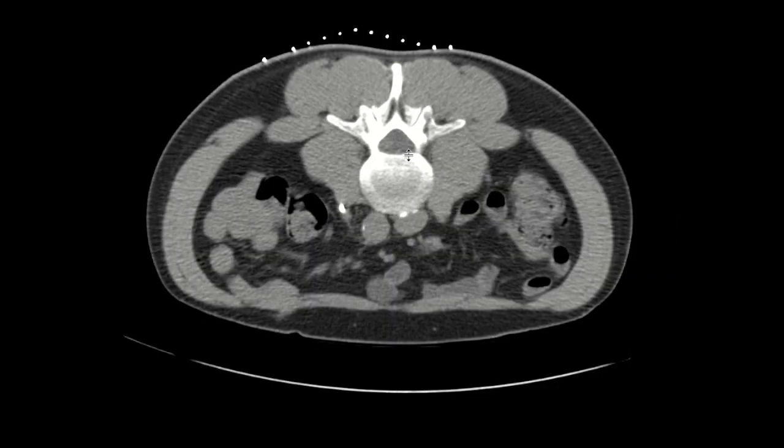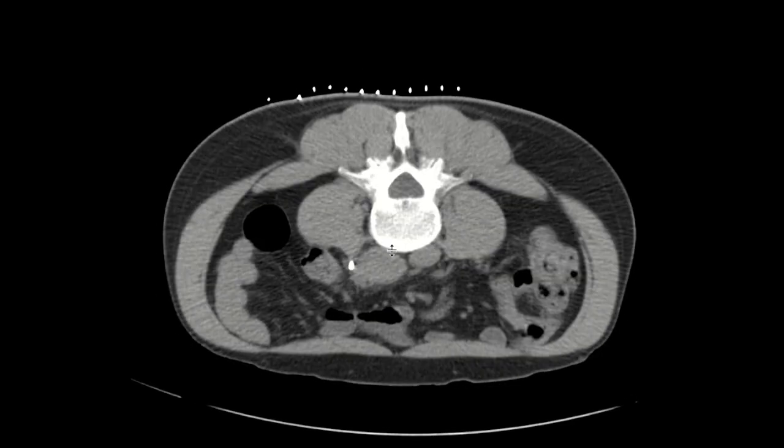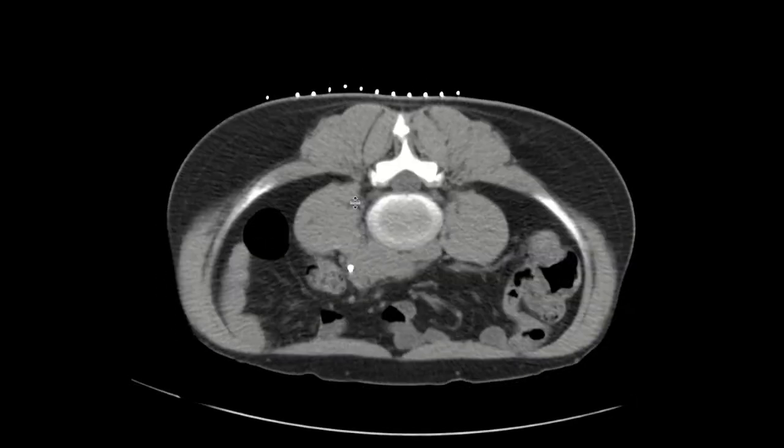So here's the CT that was performed, and this is with the tilt of the gantry. And so here's the mass right here. There's actually a ureteral stent that was placed, which is quite helpful to avoid injury to the ureter. And you can see that we ended up choosing an approach that approximated this kind of position. The problem associated with this, however, is that we know that the iliac artery is somewhere in here, so we want to make sure and confirm that that is indeed a good position.